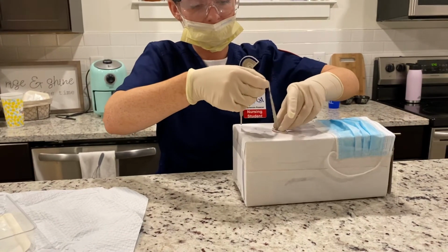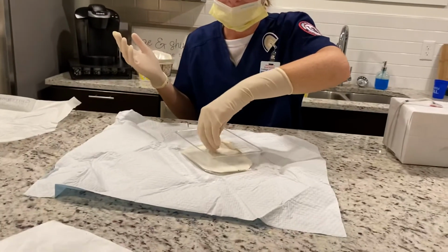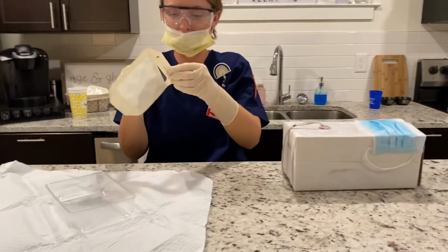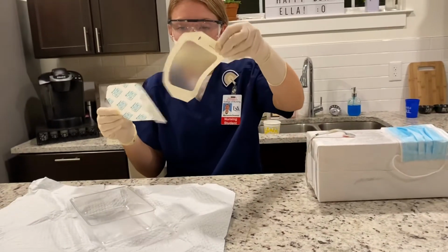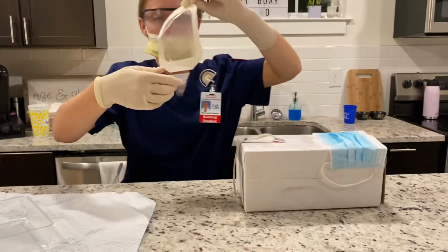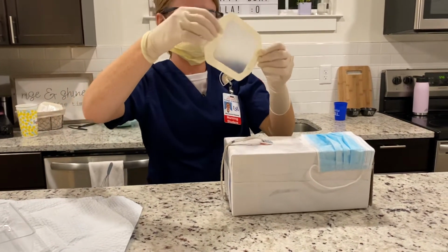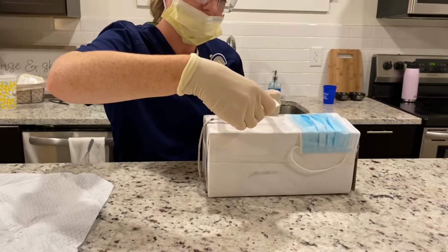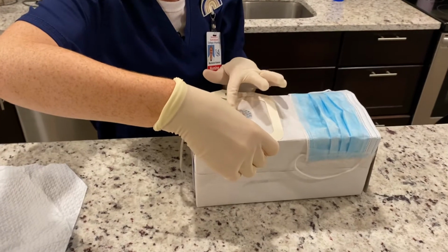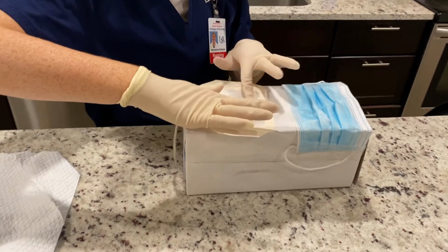Okay. Now I'm going to apply the Tegaderm, only touching the paper, and I am going to place this so the insertion site is in the center, and make sure it adheres to the patient's skin.